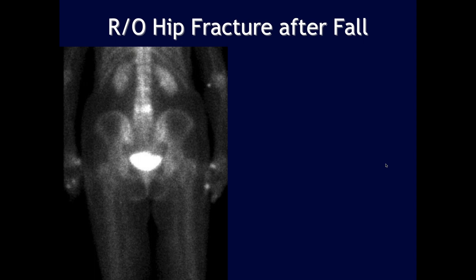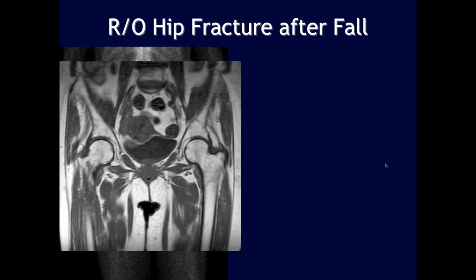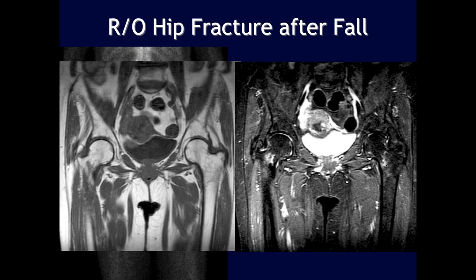We really thought that bone scan was very sensitive back when we first started doing MR scans, so we tried to do studies using bone scan as the gold standard. But what we rapidly found is that early on, within about 2 or 3 days after the event, the bone scan is routinely negative. So MR turned out to be much more sensitive than bone scanning, and we had to not use the bone scan as the gold standard. And I know in really elderly patients, it can be negative.